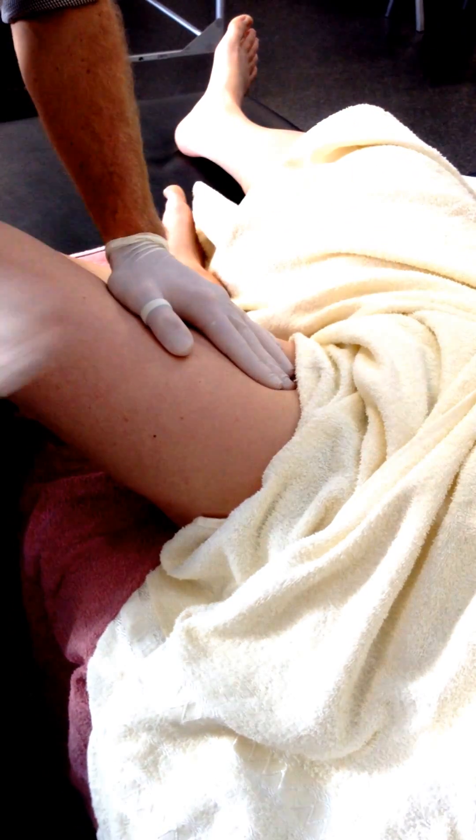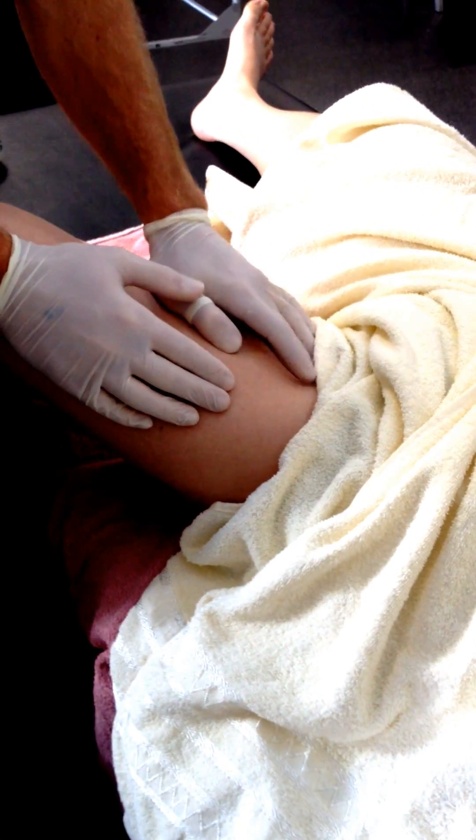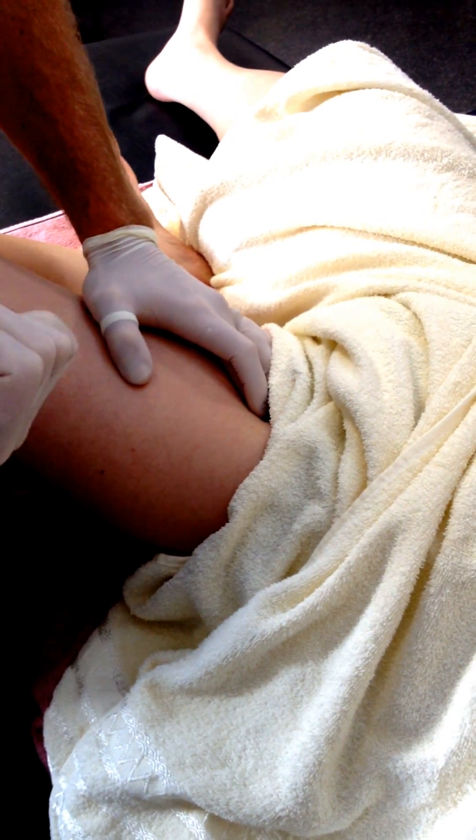Pectineus medially, psoas laterally — so you find the borders of it. There's the rectus femoris and sartorius just coming down here, and you can just sort of see my fingers sinking in there. So psoas will be more anterolateral through there.